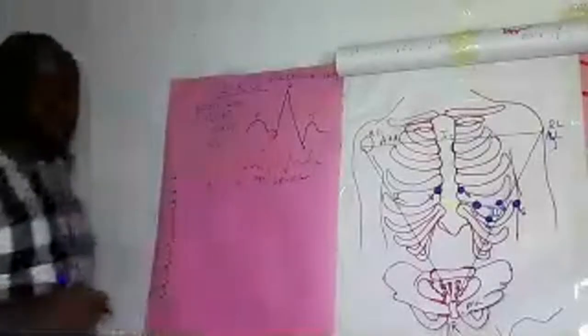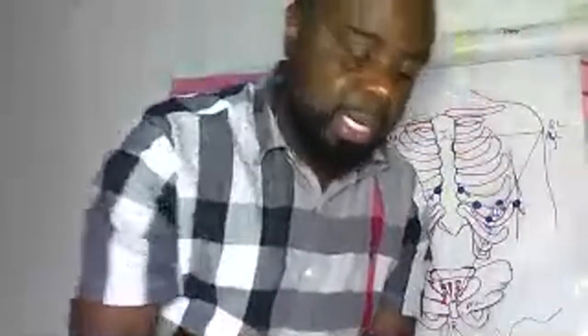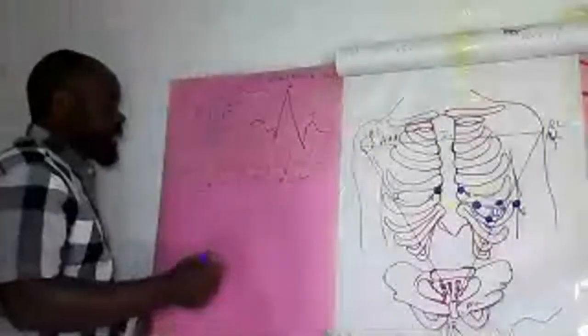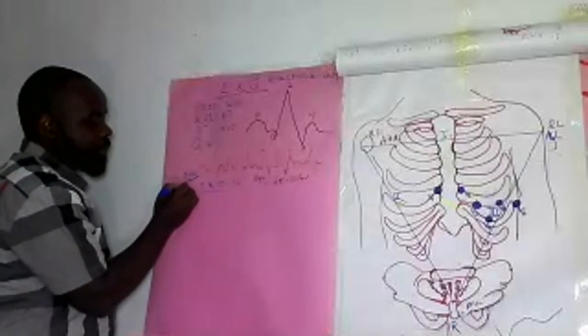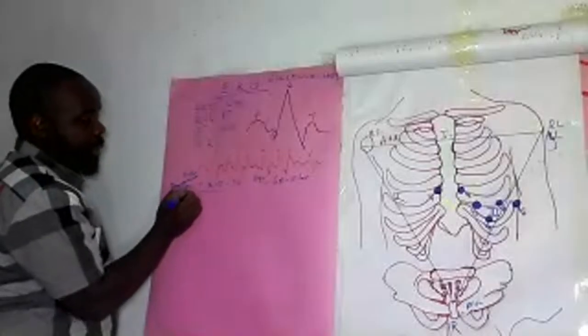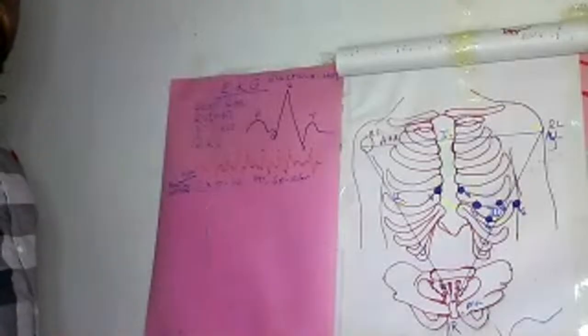What is the rhythm? On the 6-second EKG strip, how do you get a rhythm? You just get a paper. Rhythms are graded as regular and irregular. When it comes to rhythm, we talk about regular and irregular.